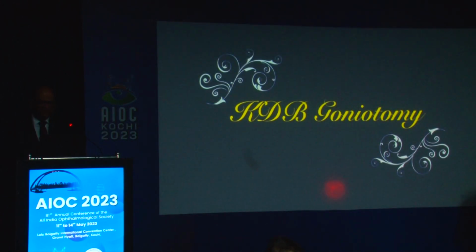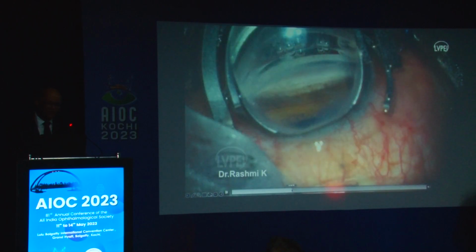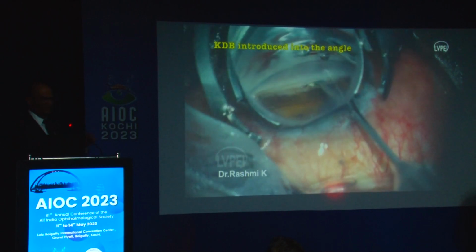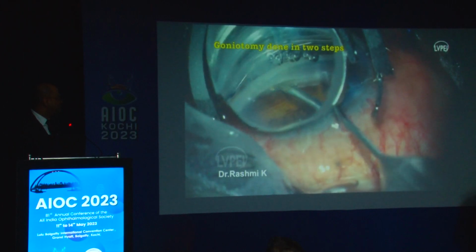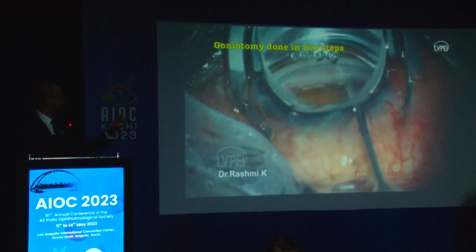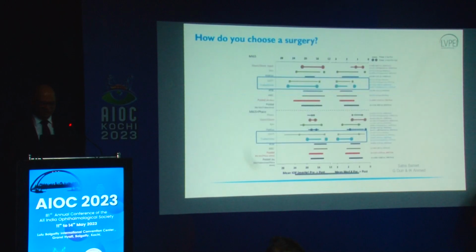KDB, this is, I'm just sharing Rashmi's video, who has this amazing video here. And looking at this video, I could not show this video. So this was beautiful. So KDB has a very, very sharp edge. And instead of just making an incision, you can take a strip out, and that strip really will open up the Schlemm's canal for the aqueous to go through. And you see a very, very wide and nicely defined cleft here. And when we followed up these patients for a short term, they were all working in these for 6 months.